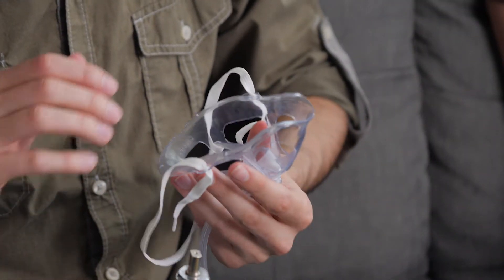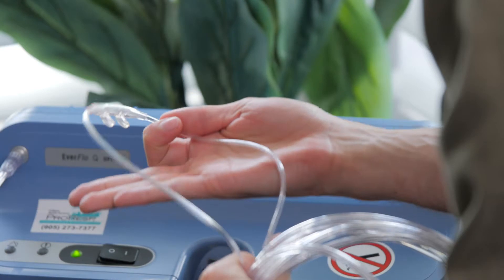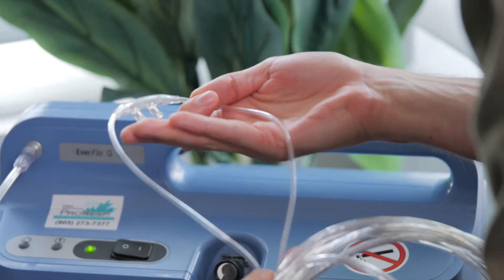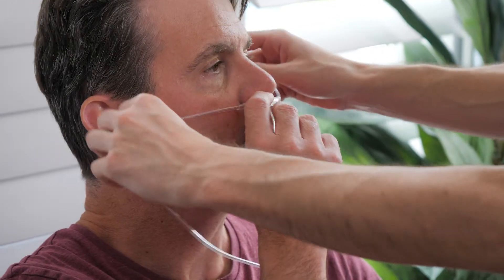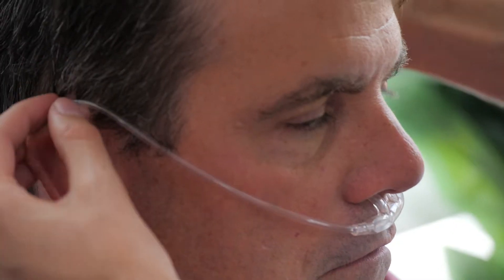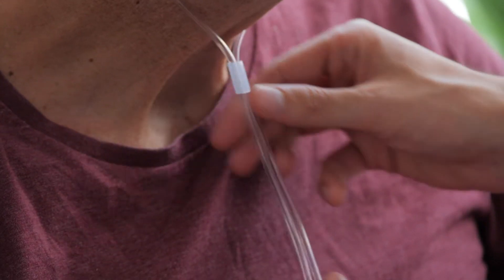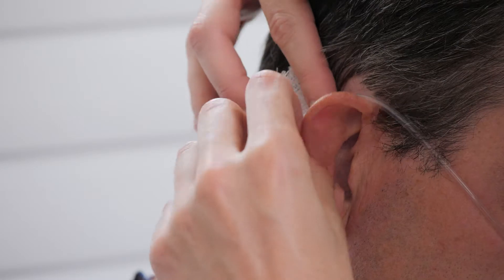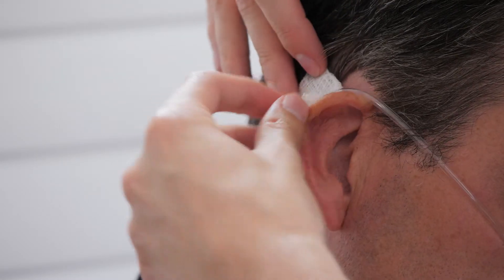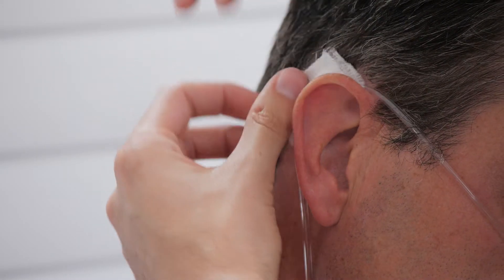Hold your hand over the opening of the mask or nasal prongs and feel to make sure that the oxygen is flowing. If the person you're caring for uses nasal prongs, put them on by placing the prongs in their nose curved down and looping the tubing over their ears. If the skin behind their ears gets sore, there are foam pads you can buy to help.